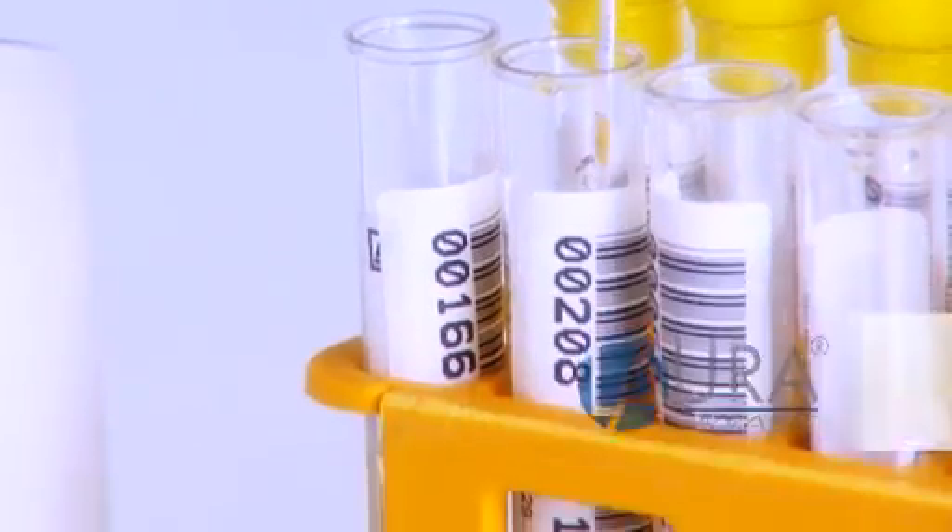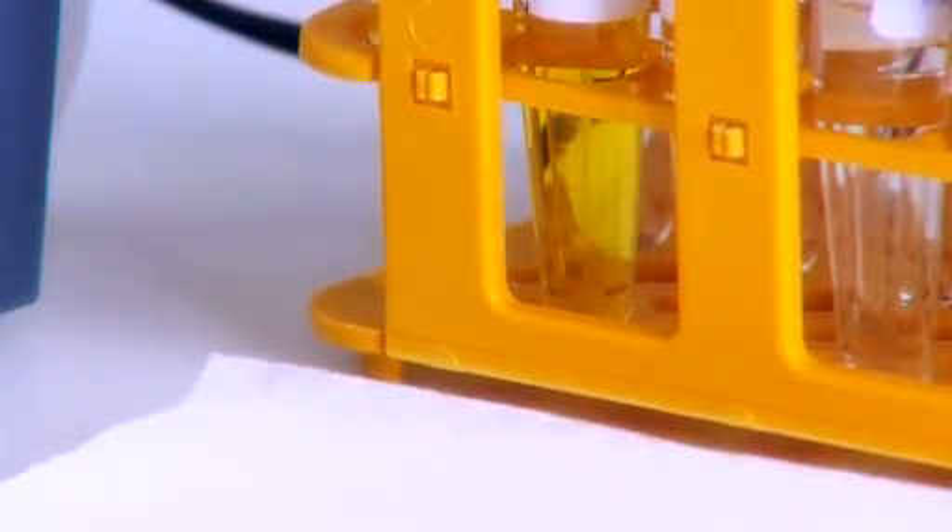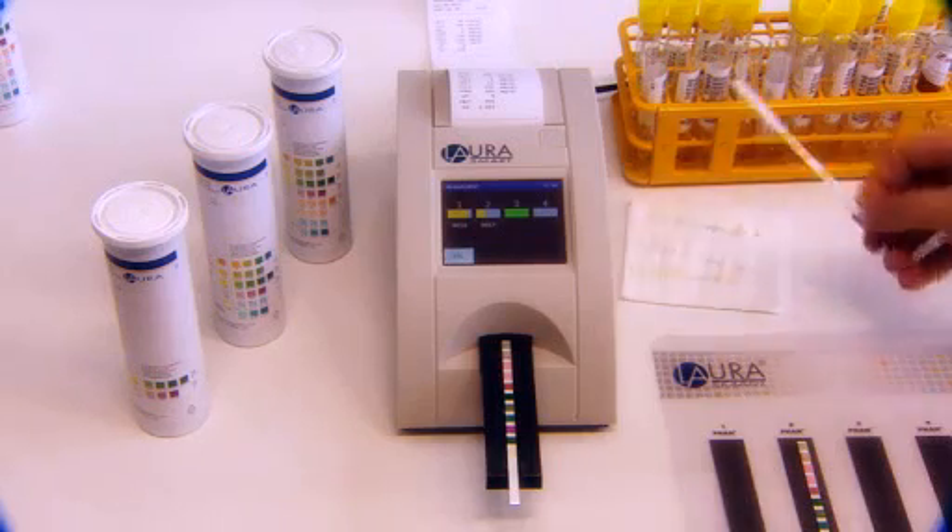The LoRa smart reader is a compact semi-quantitative urine reader. It's ideal not only for urine analysis carried out in the lab, but also by GPs and medical specialists in their clinics.